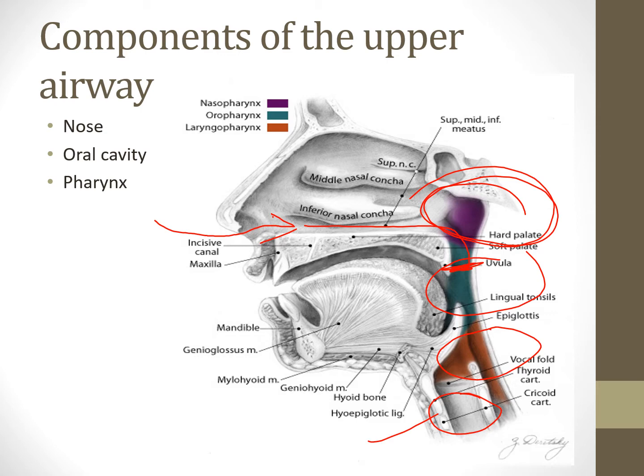So we're going to get into how to look at the appropriate size equipment for this patient, but it's also knowing the anatomy and what you're trying to displace and why. So when we're looking at this on an adult, the tongue is usually the most common airway obstruction, right?